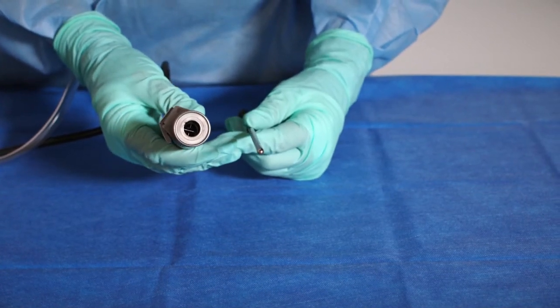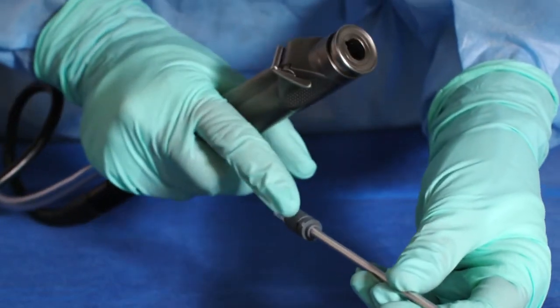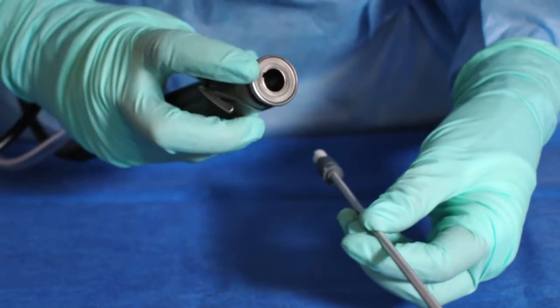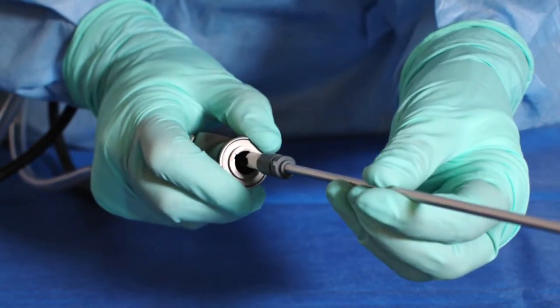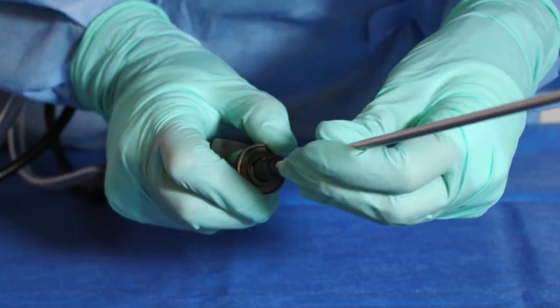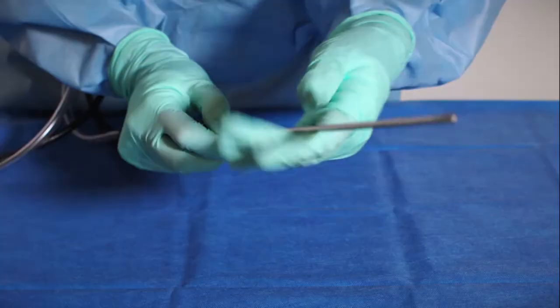The sterile team member will attach the blade. Align the knob on the blade with the notch on the power stick. Retract the clamping head and slide the blade into the power stick, then release the clamping head. Push firmly into the power stick to lock into place.